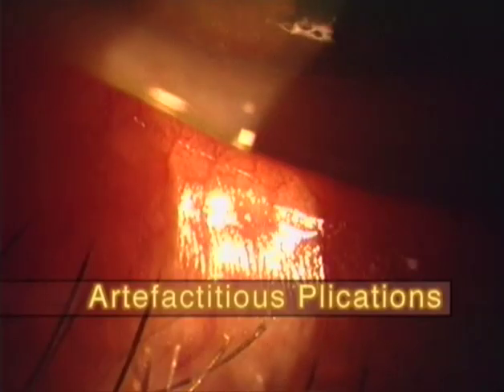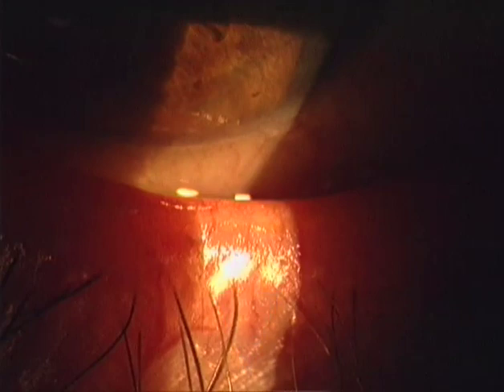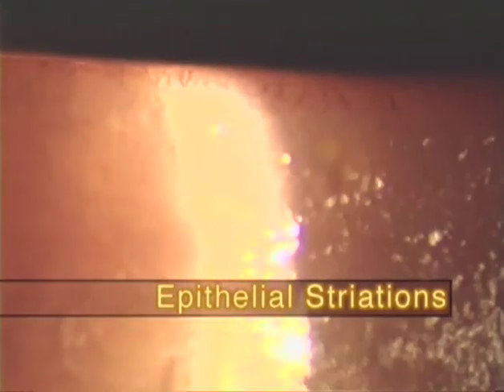But keep in mind that striations are not always the result of tissue transformation. They may be merely plications due to tractional artifacts, which are always directed towards the finger retracting the lid, and thus may occur obliquely, depending on the direction of traction. Now, in case of striations due to a real transformation of the epithelium, the fine plications occurring in the thickened layer can be revealed not only by their reflexes, but also in indirect lateral illumination, as fine refracting striations on the left-hand side of the light slit, that is, on the side opposite to the incident light.